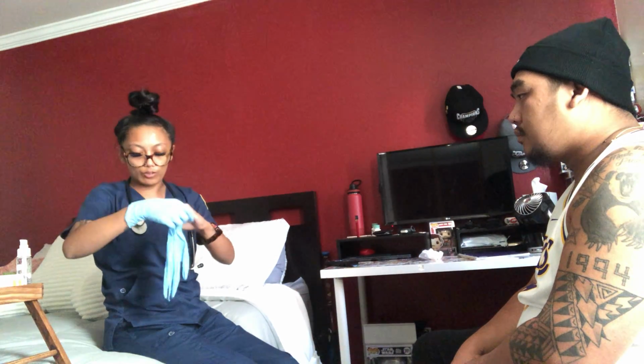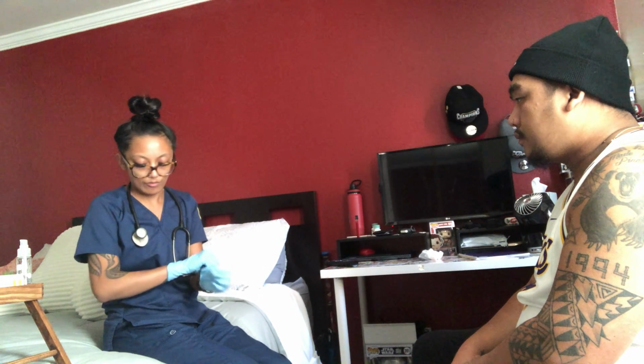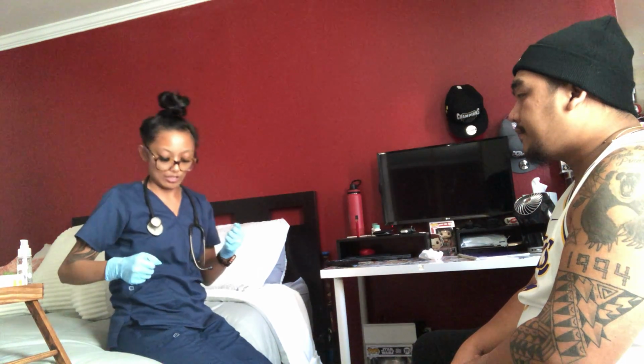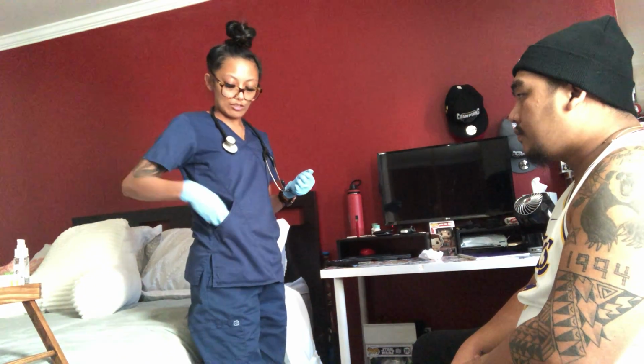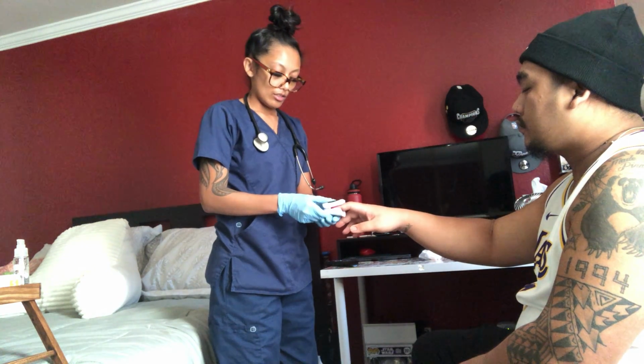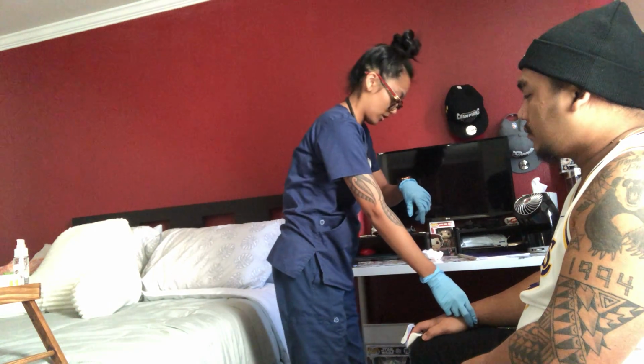Have you used an inhaler before by any chance? No. No? Okay, so I'm going to show you how to today. I'm going to start by taking some vitals. Is that okay? Yes. Okay, so I'm going to go ahead and place this on your finger. And I'm also going to take your pulse real quick.